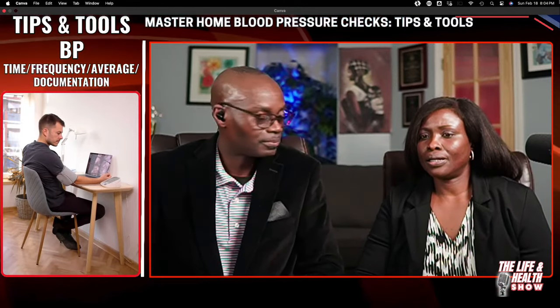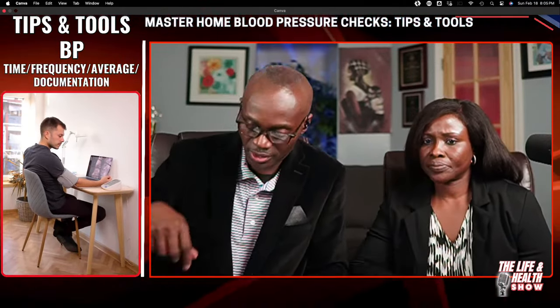And the other key is, and I think you have to document. Documentation. You don't just memorize and guess and assume, because sometimes, like you're saying, it may be low in the evening, high in the morning, or maybe every day it is continuously creeping up slowly. So if you write it down, it will make more sense to you as you look at the numbers. Or when you go to the doctor's office and you show them, they will know that this is what is happening. Slowly it's increasing and they have to do something about it. Definitely. Documentation is very, very important.